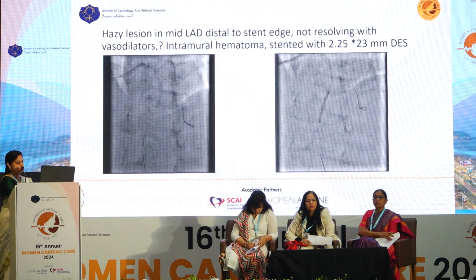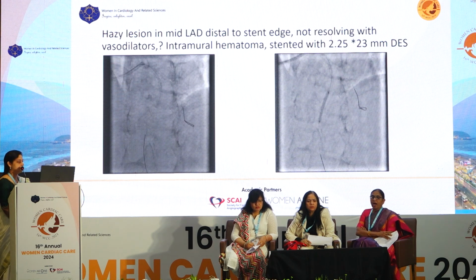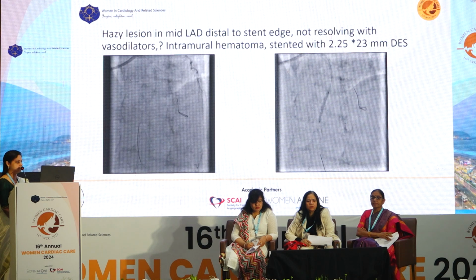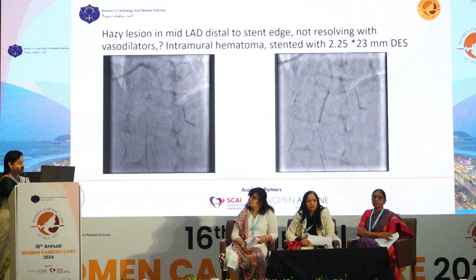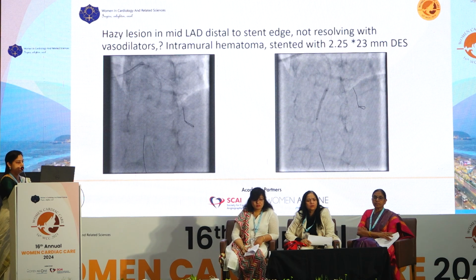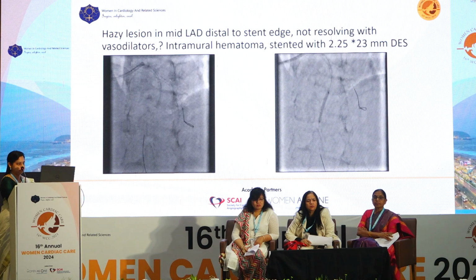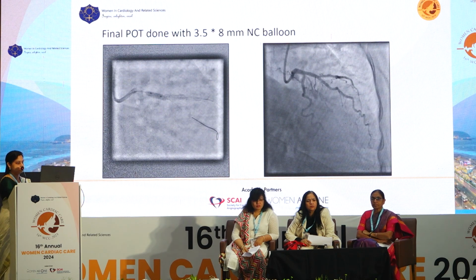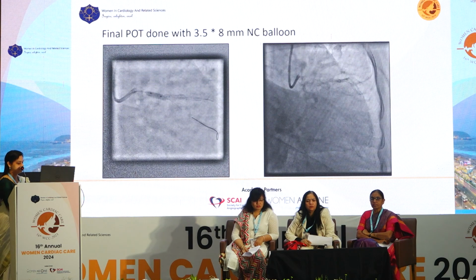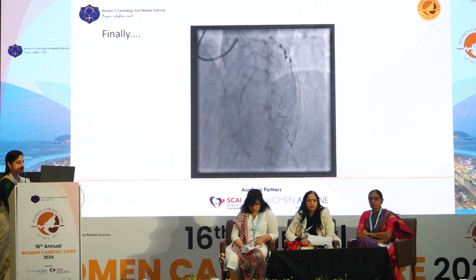And we again checked the angiogram to see the mid-LAD lesion. It was still hazy. So we gave vasodilators, but it was not resolving. So we suspected an intramural hematoma, and so we stented it. An overlapping stent was done. And then final POT with a 3.5 NC balloon. And this was the final result.